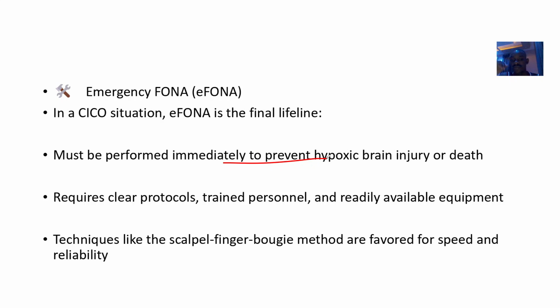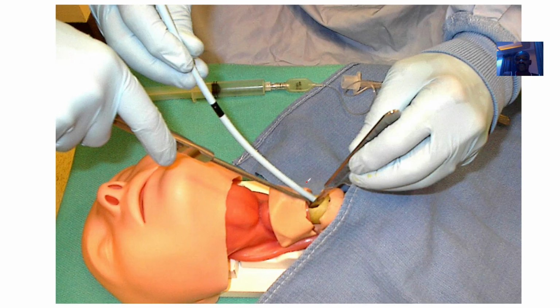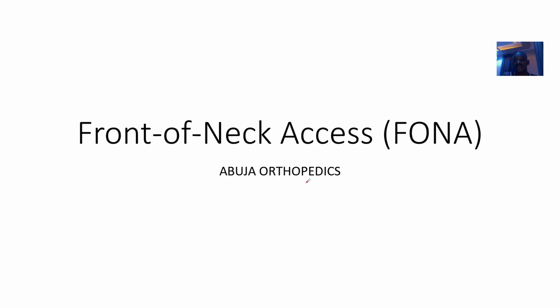It requires clear protocols, people that are trained, and equipment should be available for it. Okay, so that's what the challenge is. Landmark identification can be difficult in people that are so big, or people that fluid has accumulated in their body. That's edematous patients. Then stressful conditions may impair performance. Okay, so such medical providers should be very calm in such situations. So that's just what the front of neck access simply entails.